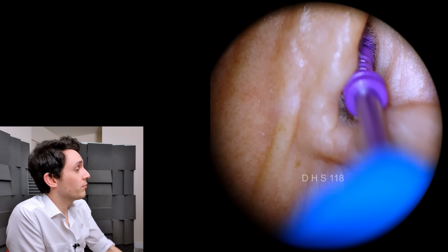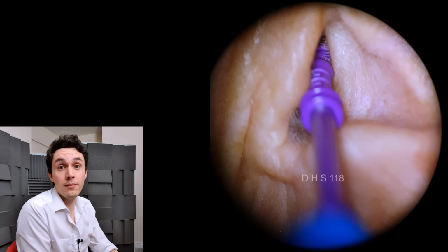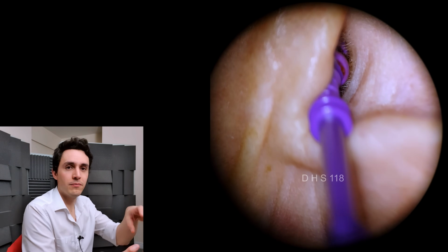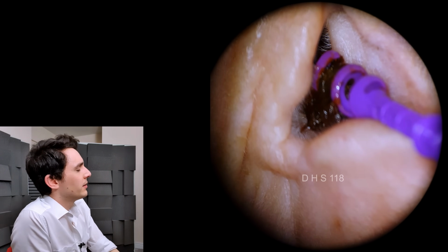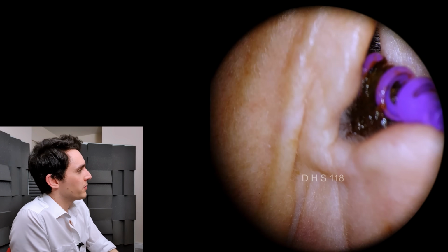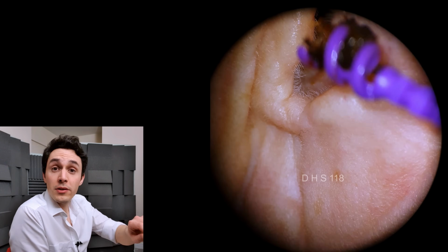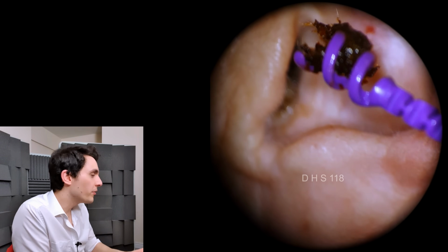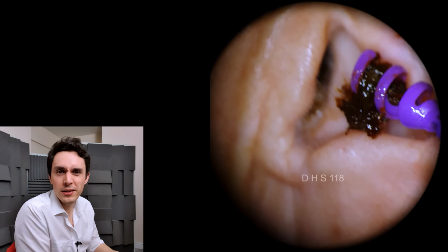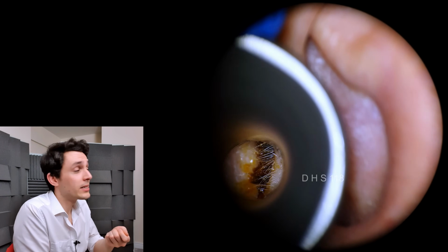You can see I'm just pulling it out here, and we will recover at least one chunk, the first part of the impaction. There it is. A little bit of olive oil in there. The patient used a little bit of olive oil before visiting the clinic. As you're inserting it and then you pull it, it very rarely hurts the patient. On the odd occasion you'll get someone who feels a little bit of pressure or discomfort, in which case you stop advancing the device and you simply retrieve it.